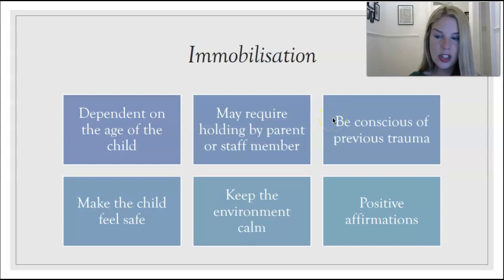Yeah, so immobilisation depends on the age of the child. Obviously, if a child is older, they won't need to be immobilised. They're able to just get in the position and stay in the position themselves. Sometimes children maybe require their parent to hold their arm, or a staff member, maybe a ward nurse or a healthcare support worker, to hold the position.